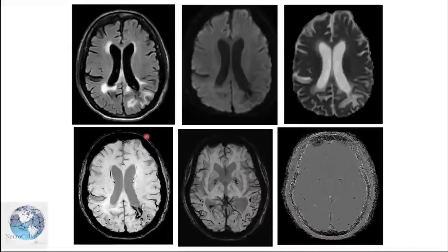initially our diagnosis before the conference was vascular dementia, because of the presence of infarct. But we asked why the white matter changes were not so much, given the patient's underlying diabetes and hypertension. So we looked at the other sequences carefully, and then we noticed there are multiple small hemorrhagic areas at the periphery of both parietal occipital regions.